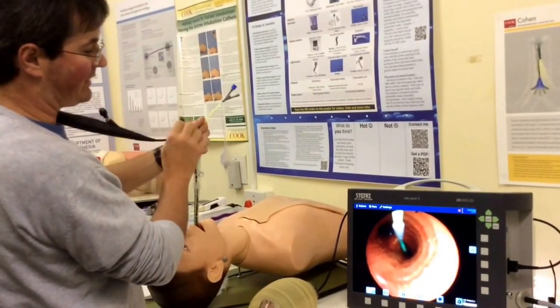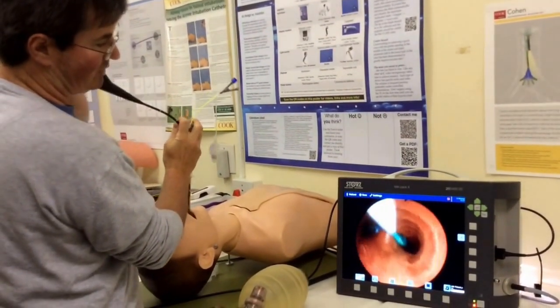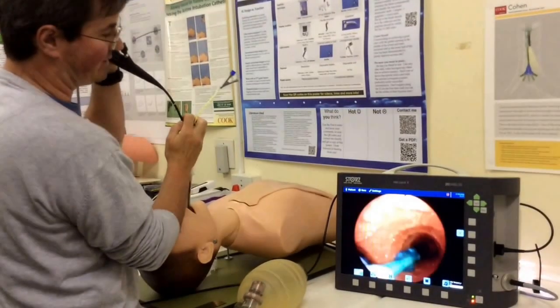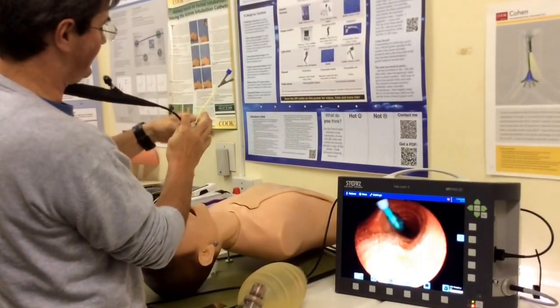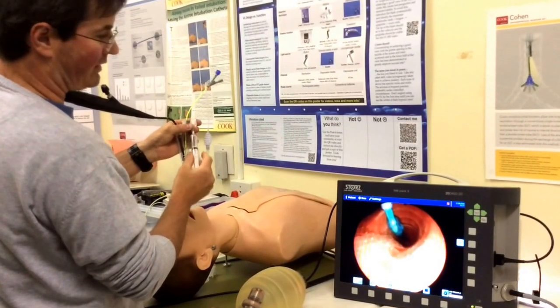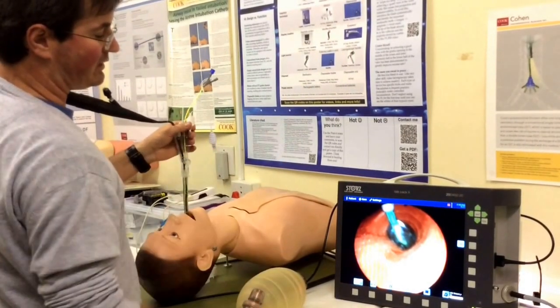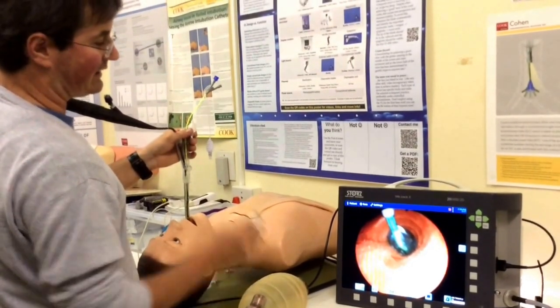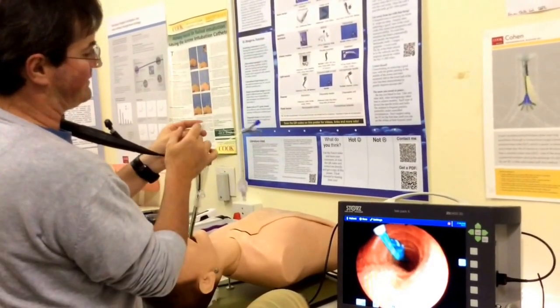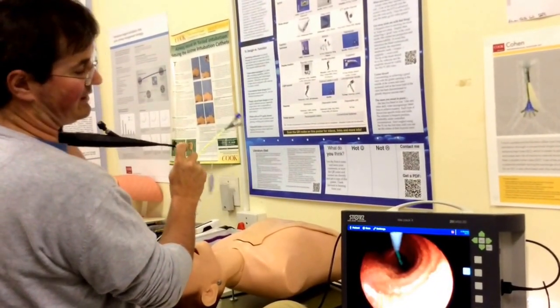When I want to isolate the lung, I pop my scope back down. I can see what looks like a blue cuff on one side — the left one looks more blue and the other looks more yellow. If we want to isolate the right lung, I'll inflate the yellow cuff. You can see the blocker inflating — I get a minimal occlusion pressure just to occlude that lung and allow it to collapse. I then label the pilot balloons 'right' or 'left' to maintain orientation.